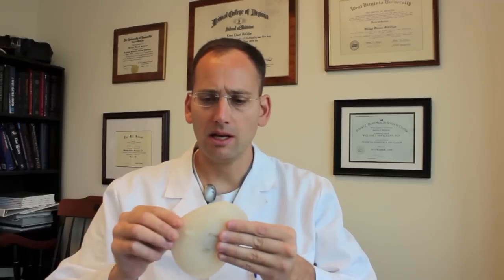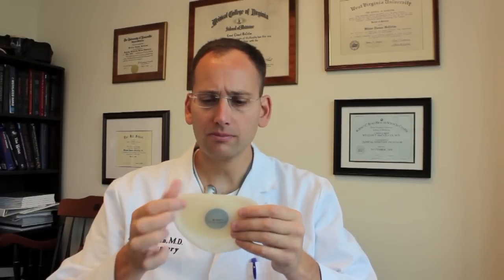As you can see here, this is a standard tissue expander. It's basically a soft plastic and right here it has a port. This port is basically a piece of metal and the port communicates with the inside of the tissue expander.